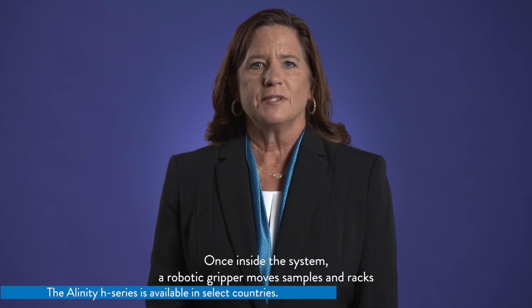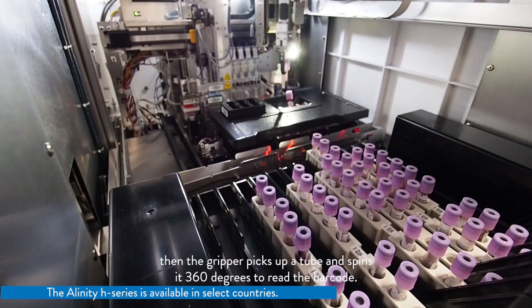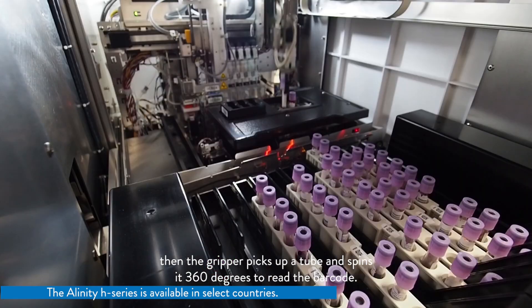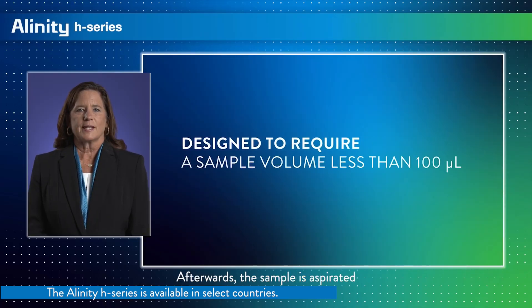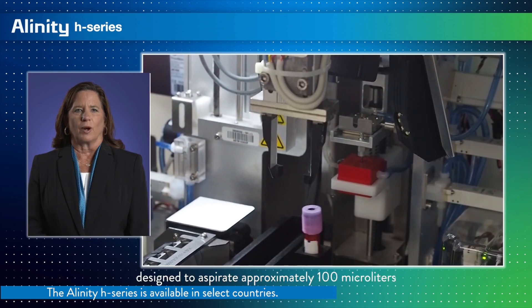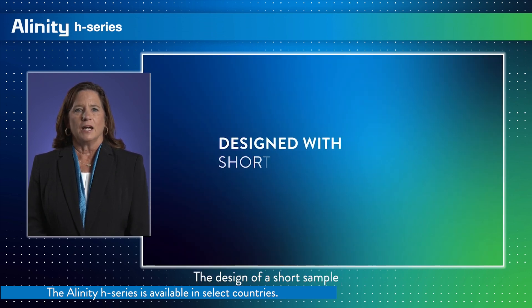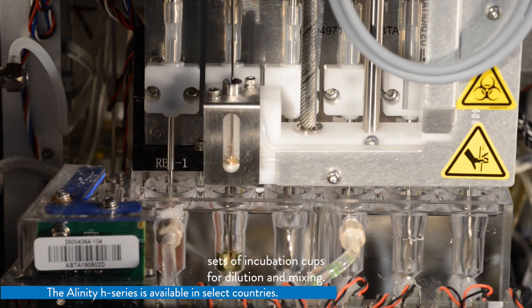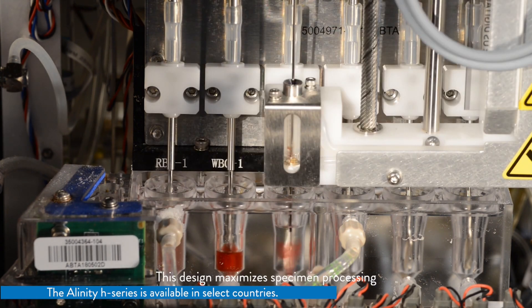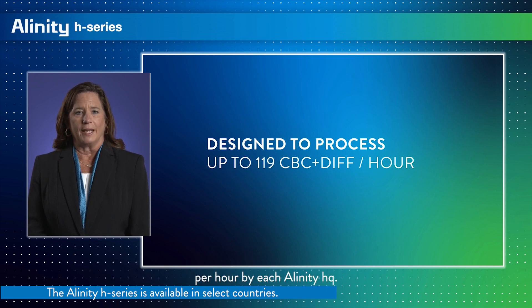Once inside the system, a robotic gripper moves samples and racks freely through the system. A digital camera confirms the number of capped tubes present. Then the gripper picks up a tube and spins it 360 degrees to read the barcode. Next, tubes are moved through the inversion mixing process. Afterwards, the sample is aspirated using a bottom sensing mechanism designed to aspirate approximately 100 microliters for both opened and closed tube sampling. The short sample detection mechanism helps identify samples that do not have enough specimen to analyze or that may be clotted. The specimen is then dispensed into one of two sets of incubation cups for dilution and mixing. This design maximizes specimen processing to support a throughput of up to 119 CBCs plus diff per hour by each Alinity HQ.